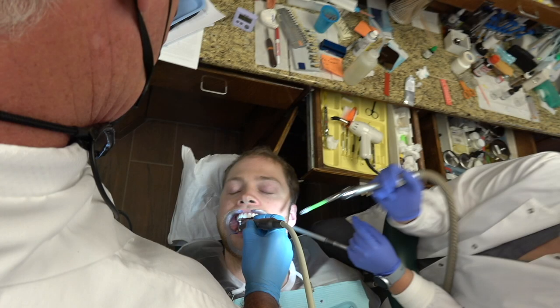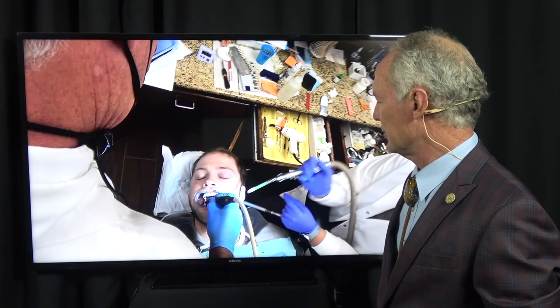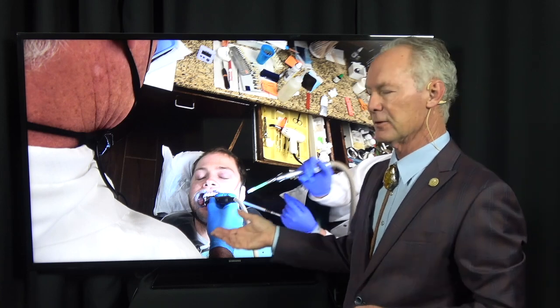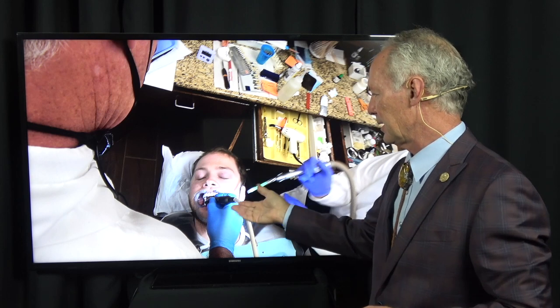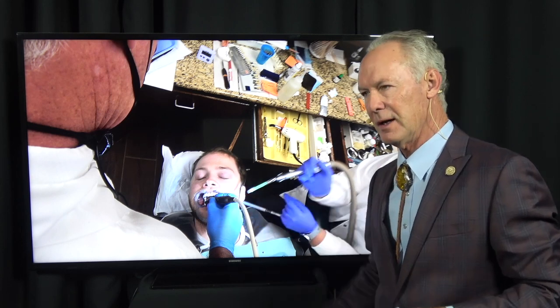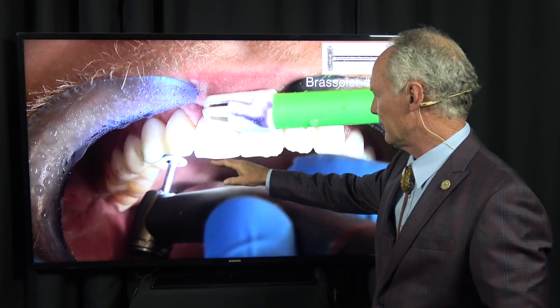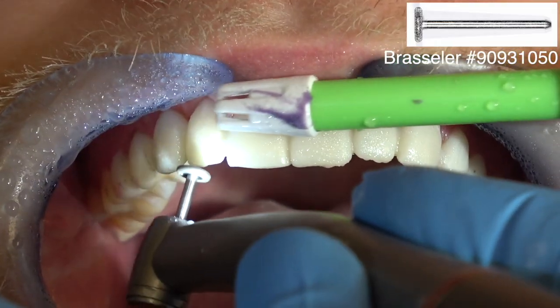Then I'm going to check the incisal plane of the provisional restorations because I'm going to send an impression of the provisionals and a photograph of the provisionals with the lips retracted so it shows the pupillary line. And I'm going to say to the technician, the incisal plane of the provisionals is good. You can use some artistic creativity, but basically they're aligned correctly. But I'm going to stand up and stand in front of the patient to adjust the incisal plane.